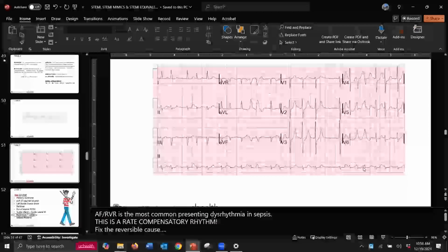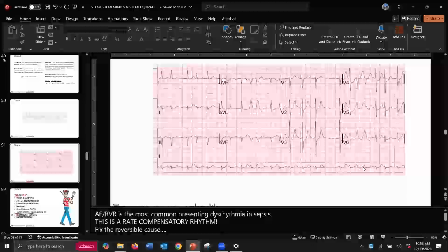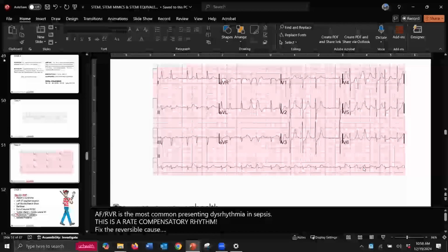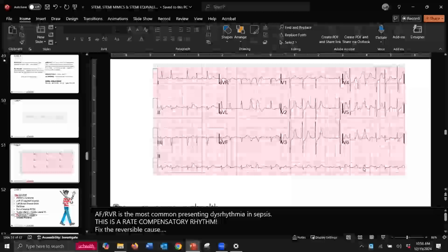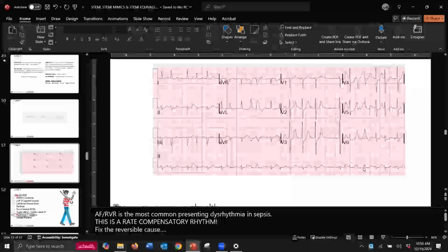Yeah, no. Okay, good. We're gonna increase his intravascular volume. And hopefully, how do we know by looking at the monitor, what's one surrogate that we're doing the right thing? Let's say we give him a 500 mL bolus. What are our expectations if that's successful? That blood pressure should go up and that heart rate should come down.